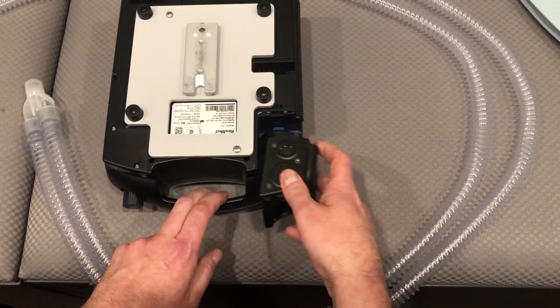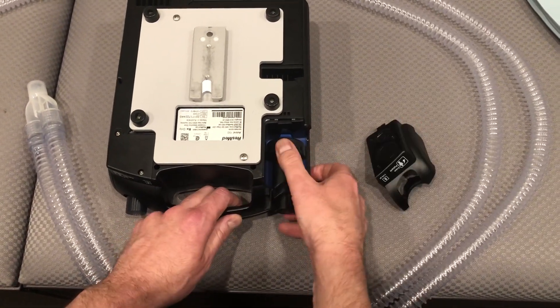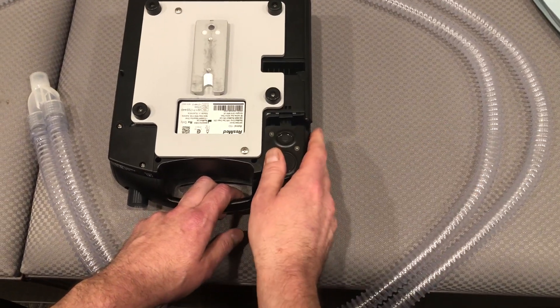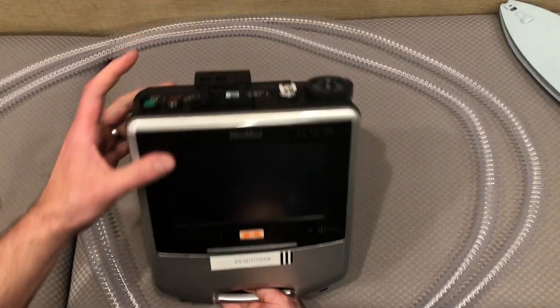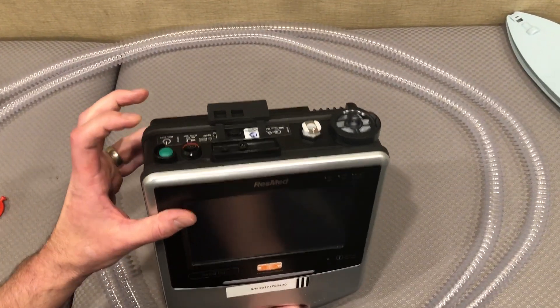We want to put the cover back on, turn the vent back over, and then turn it on from the back.